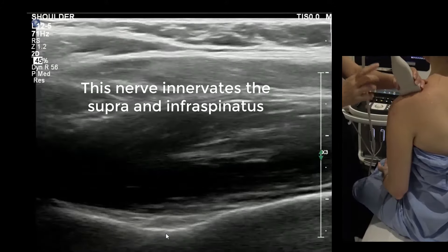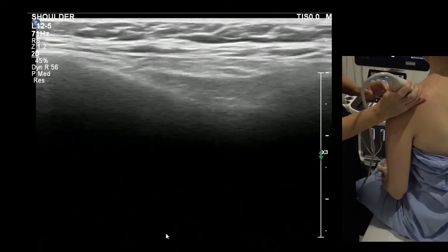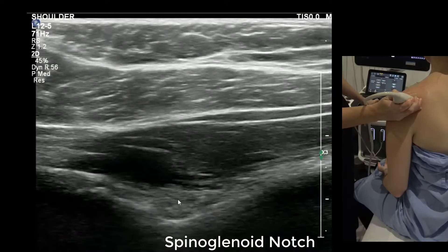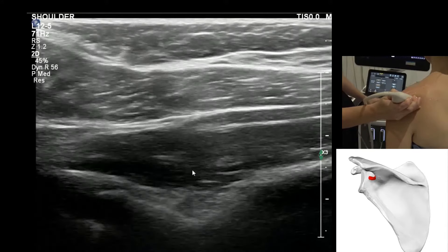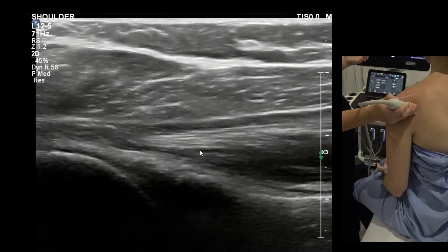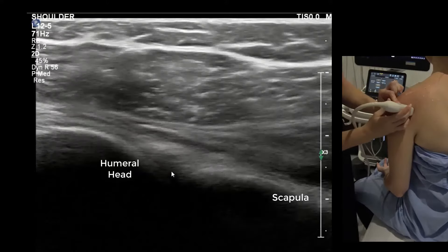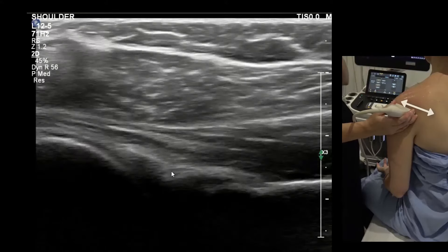Drop the other side of the spine of the scapula — just drop over the edge. This little groove is the spinoglenoid notch. If you can see that, you're probably on infraspinatus, maybe teres. The posterior glenoid view we want is just below that notch — slide down. The camera is slightly oblique, pointing down that way immediately.